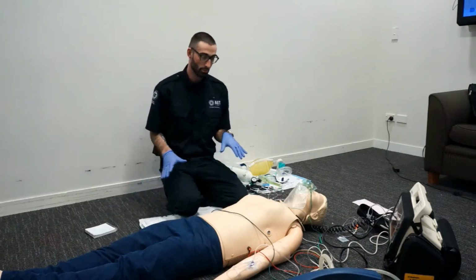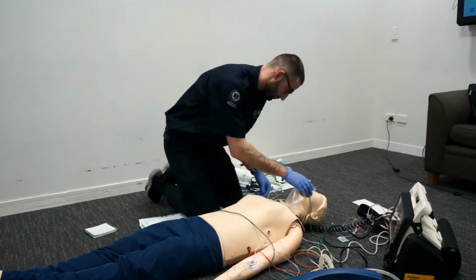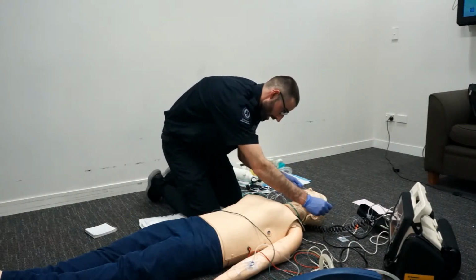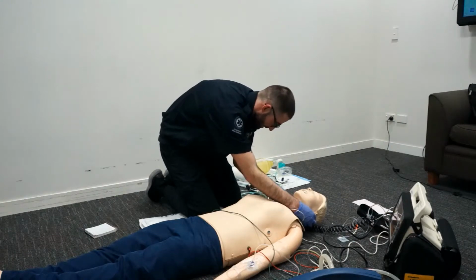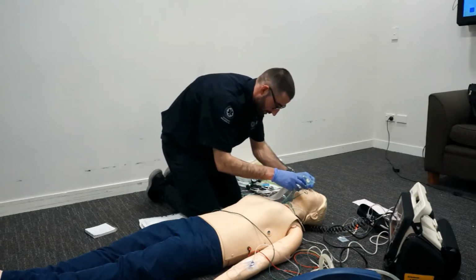Okay. As we're treating a severe TBI, we have a reservoir mask attached. So we'll just detach that briefly and attach our nasal prongs. The reason for the nasal prongs is we want supplementary oxygen, and we also want to prolong desaturation during laryngoscopy when the ETT tube is being placed by the ICP. We then reattach that reservoir mask.